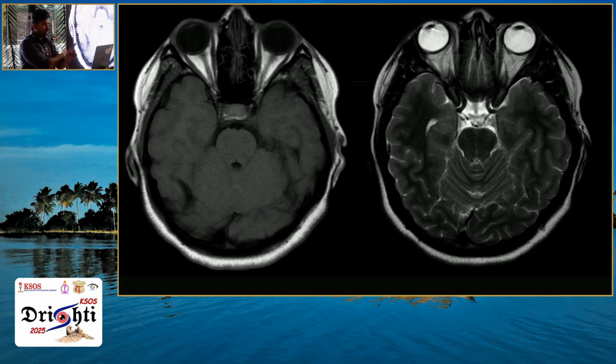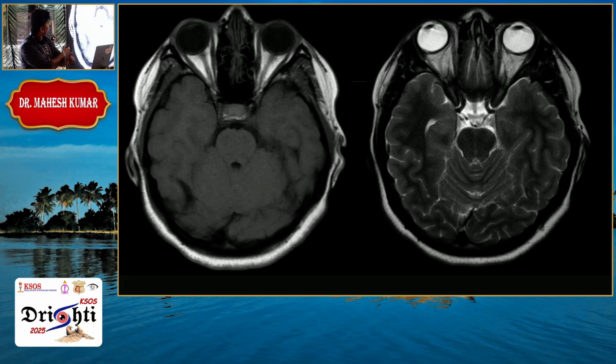One is water and another one is fat. Water is CSF and vitreous. We'll first talk about water. Vitreous is water. In T1, it's darker in color. On T2, water is white, it is brighter in color. On T2, water appears white, like we used to study in the MBBS days, "World War II, water white 2": water appears white on T2.